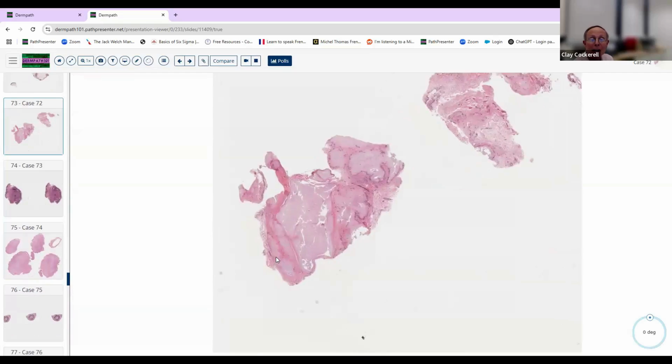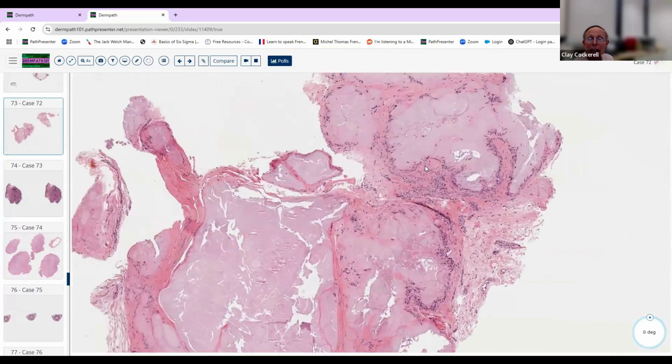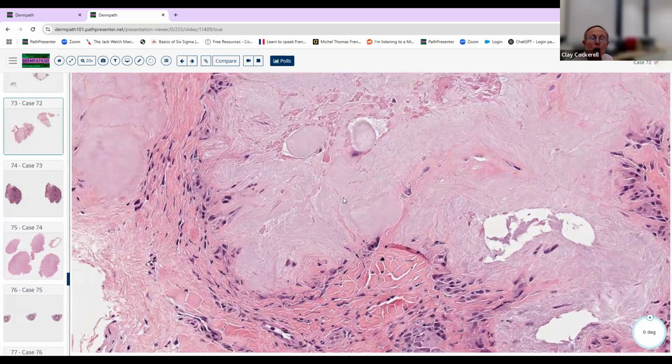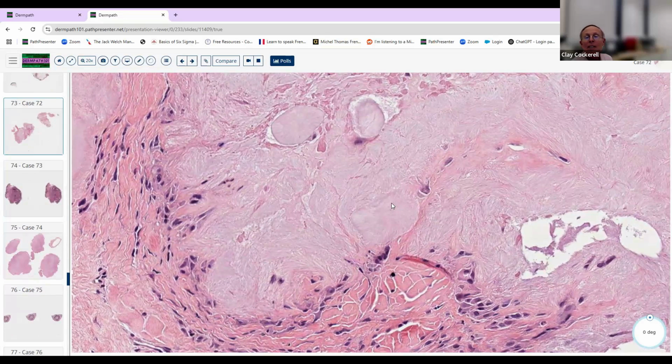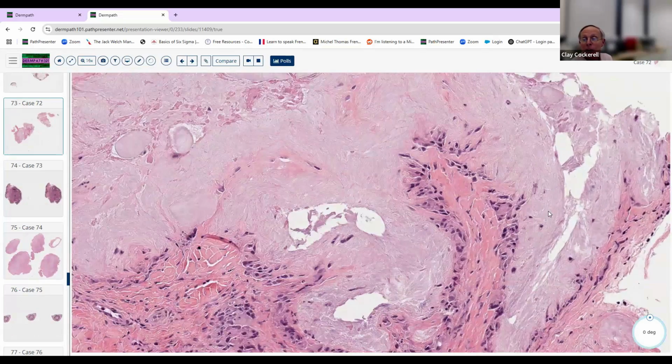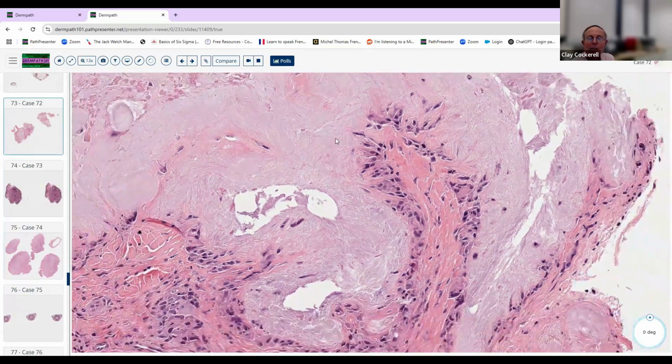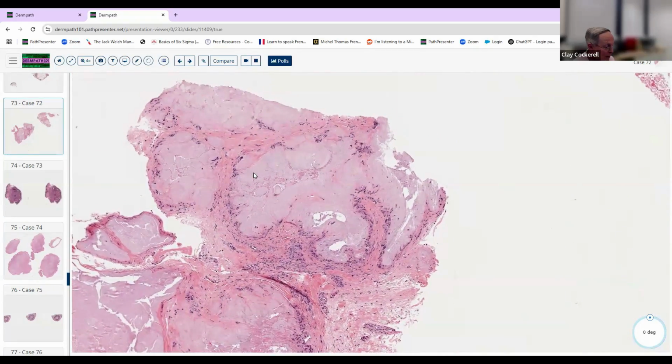All right, here we've got another deposit, pathognomonic deposit, feathery, grayish ghosts, crystals of gout, gouty tophus. And this one's got a little bit of granulomatous inflammation in the periphery and sometimes simulated palisaded granuloma. But this is yet another one where you need to recognize this feathery, grayish light. It looks almost like a cloud, feathery gray cloud with granulomatous inflammation. This is a gouty tophus. Nothing else looks like that.